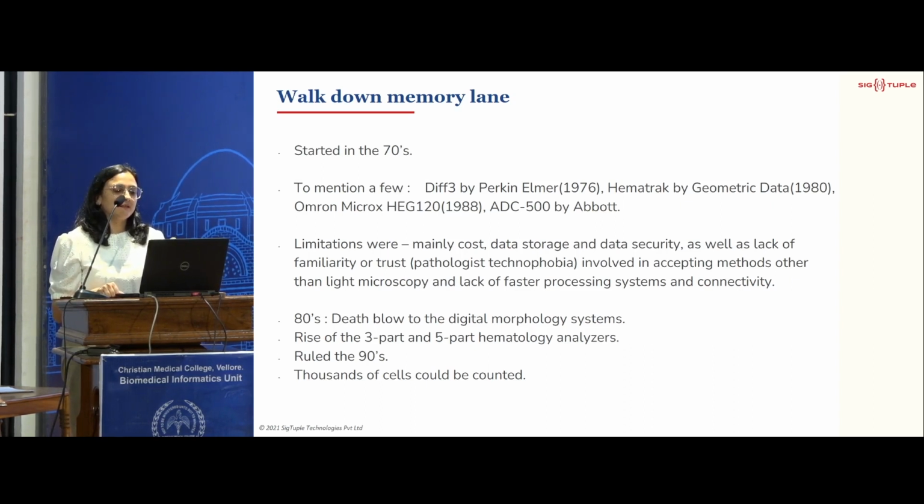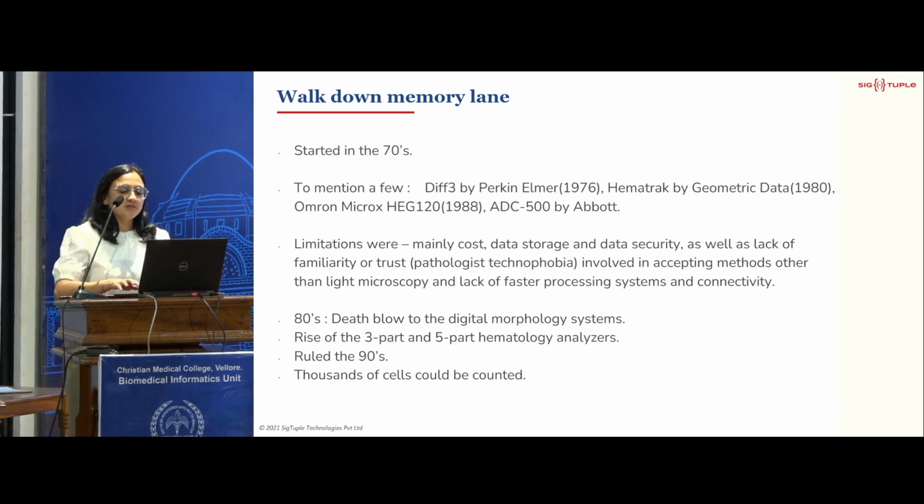I think it is called pathologist technophobia. We don't want to lose our microscopes and replace them with the laptop. We love our microscopes a lot, just like our intensivists and internal medicine people love their stethoscopes. So that is why it did not click, and also there was a lack of faster processing systems and connectivity.